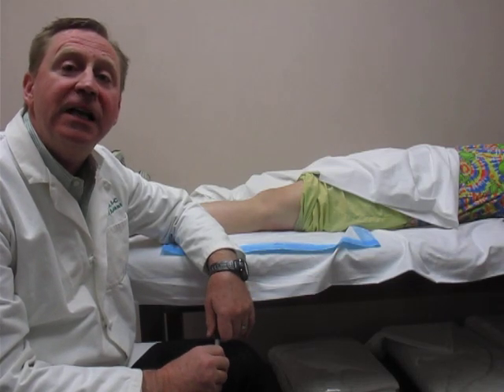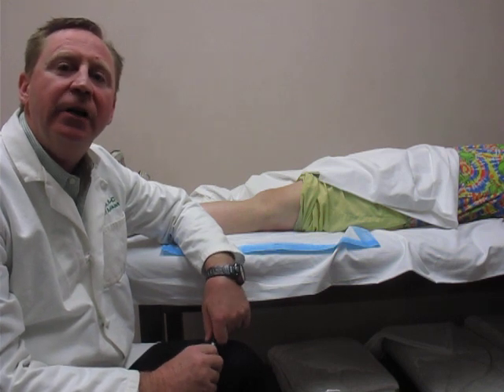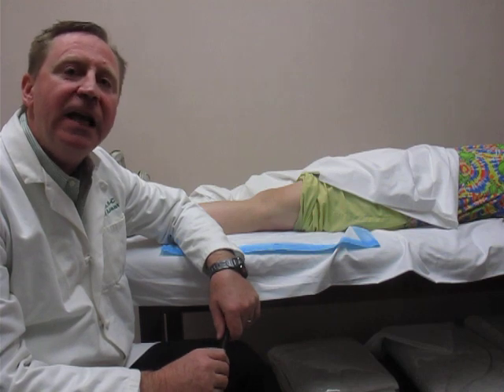Hi, I'm Tom Gokey with Orthopedic Educational Services. Today we're going to talk about knee aspiration. I'm going to give you five tips that will help improve your technique in performing your knee aspiration.